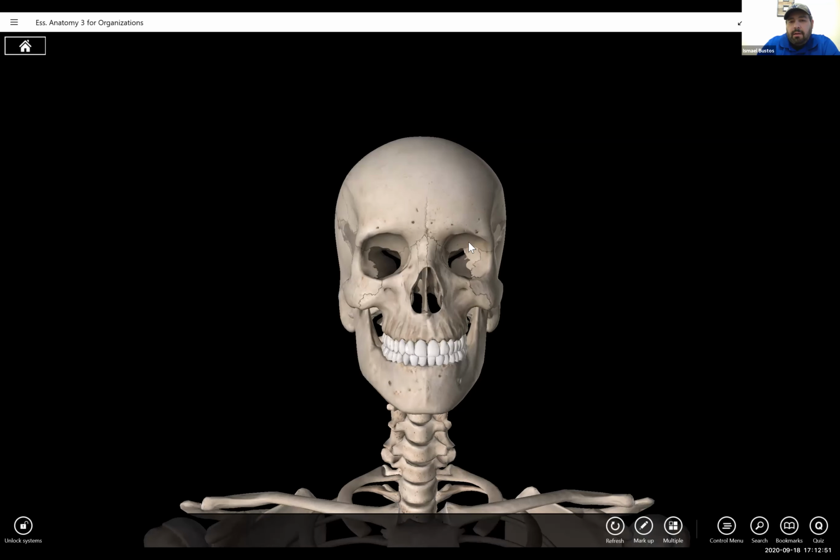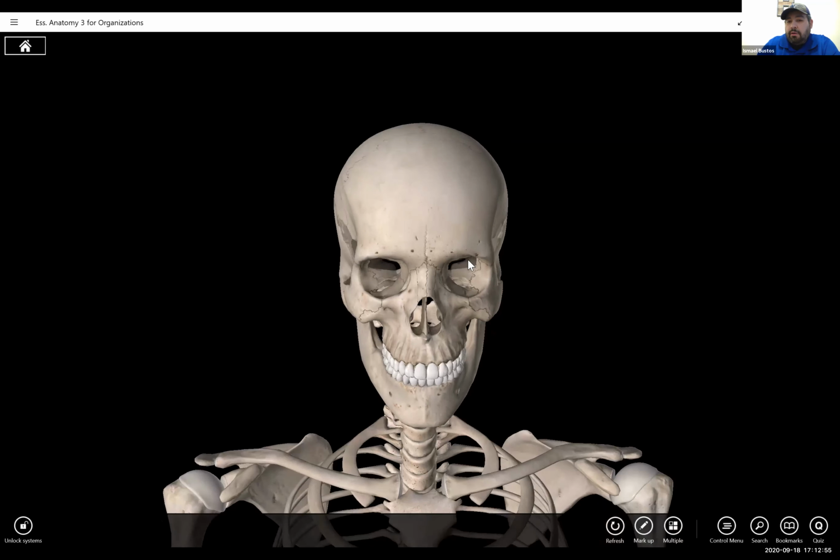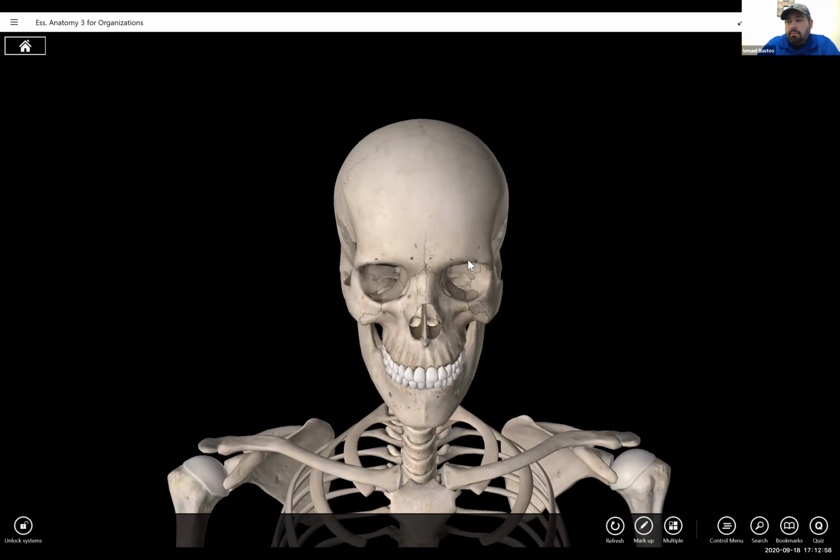If I have not enough angle, too little angle, they start filling the orbits. I will talk about that more. Give me 1 second here.